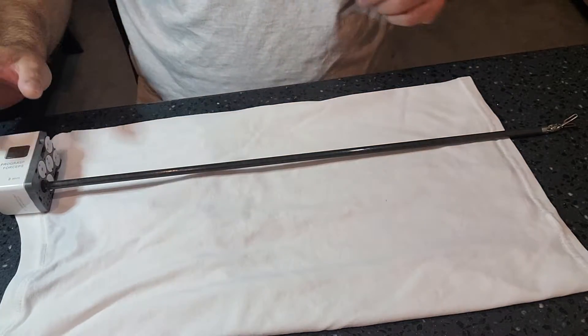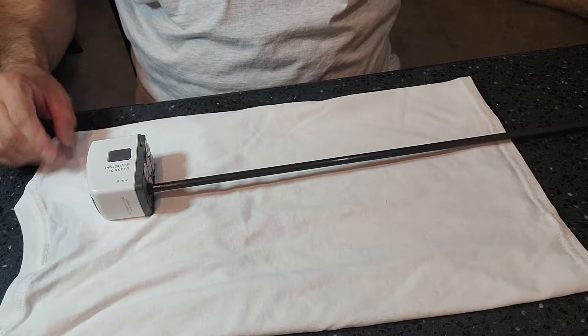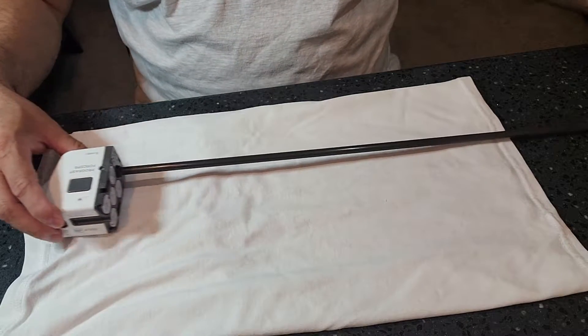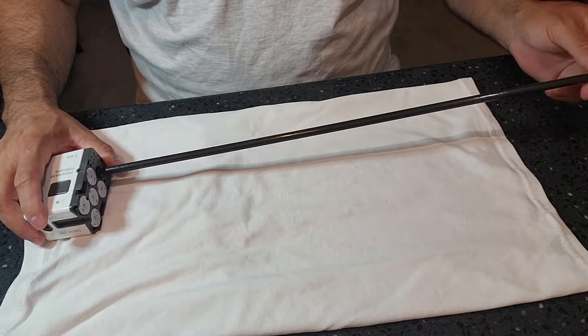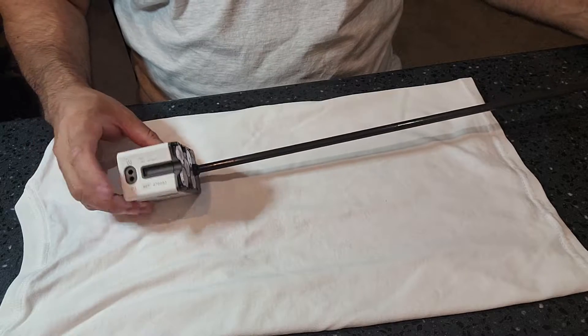What's going on guys? Welcome back to WDYDCSP — What Do You Do as a Central Sterile Processor? I am Jesse Lopez and I am back with another how-to video. So stay tuned guys. We are back with a how-to video, and today we have some of y'all love them, some of y'all hate them — the complex surgical instruments known as the robotic arms.